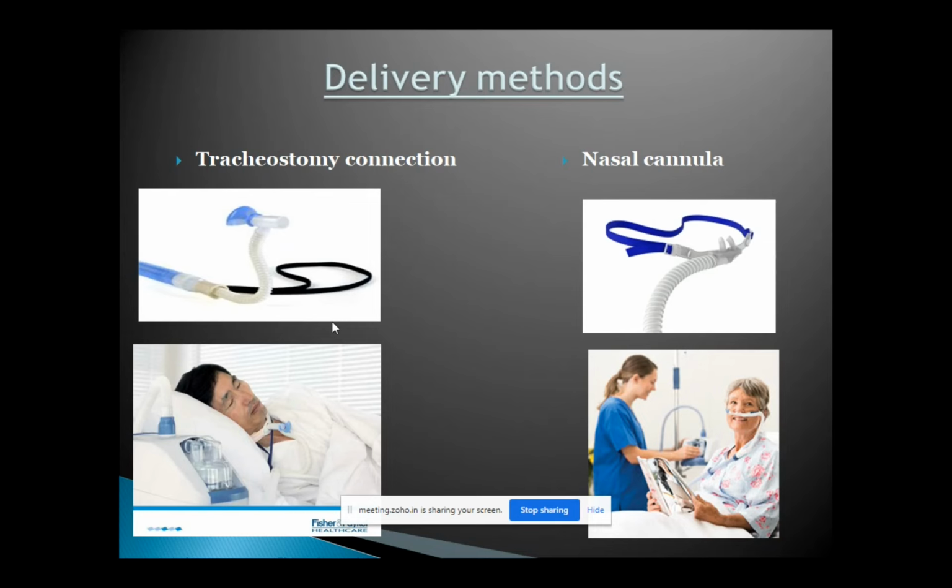But with this device, you can change the interface from nasal cannula to the tracheostomy device. But obviously, it's single patient use only, so you don't move the machine and change the interface to a different patient. Once the machine is set up for that particular patient, it stays with that patient.